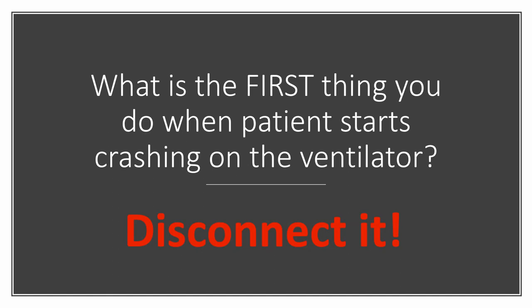What disconnecting them from the ventilator achieves is, if they were breath stacking, if the ventilator is delivering breaths on top of breaths on top of breaths, and you had this high pressure within the chest, you could decrease the venous return. That could cause the patient to become unstable. Disconnecting them from the ventilator fixes that. You may disconnect them and have this huge rush of air that comes out, and the vital signs could normalize.